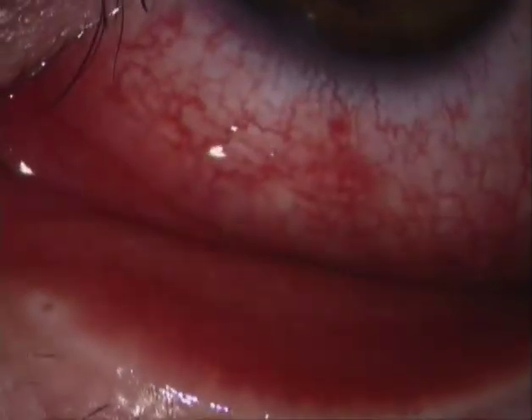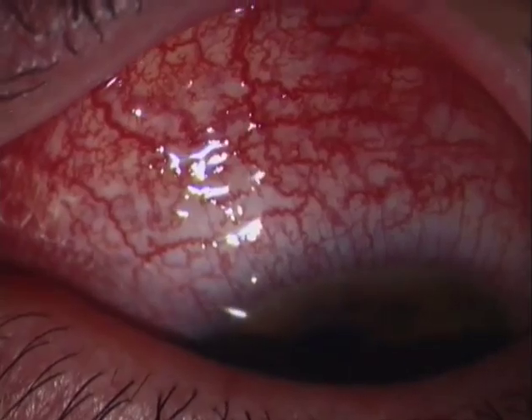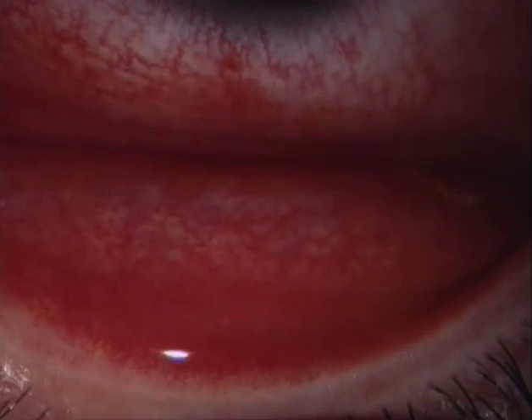They affect the bulbar conjunctiva over the entire surface of the globe. They also affect the lower lid, the orbital conjunctiva, as well as the tarsal conjunctiva, whereby there is a higher density of capillary buds in the narrow band overlying the tarsus.